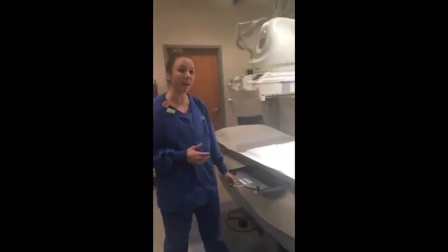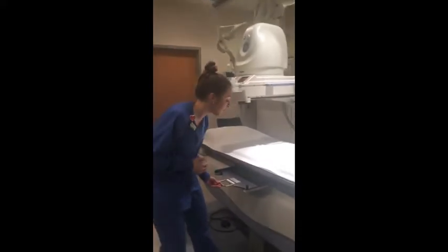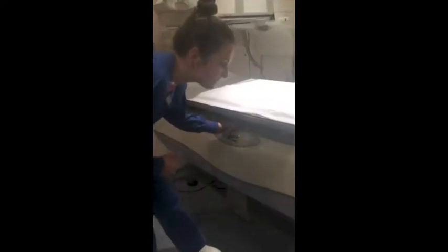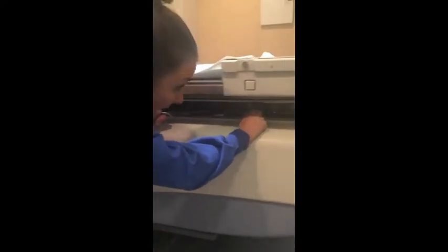This is your bucky. The bucky is not going to be used for fluoro, but it's very important for you to slide the bucky all the way in and then use the handle to pull it so that you can slide it all the way up and it'll lock in place. The bucky needs to be locked in place for the entire procedure if you're doing a fluoro procedure.